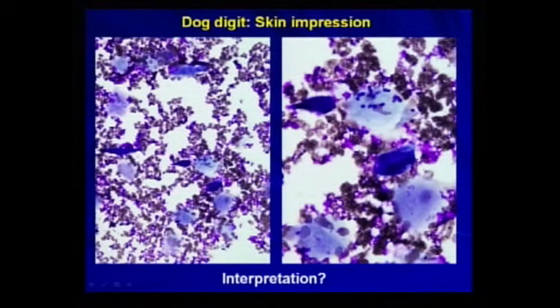I see some keratin debris. Not sure if that probably came from the dog. Maybe it's a crusty little lesion. And then I see numerous large polygonal, occasionally nucleated squamous epithelial cells. And keratinized squamous epithelium has this very translucent teal blue appearance. Okay, but if we look around we can see these structures right here.